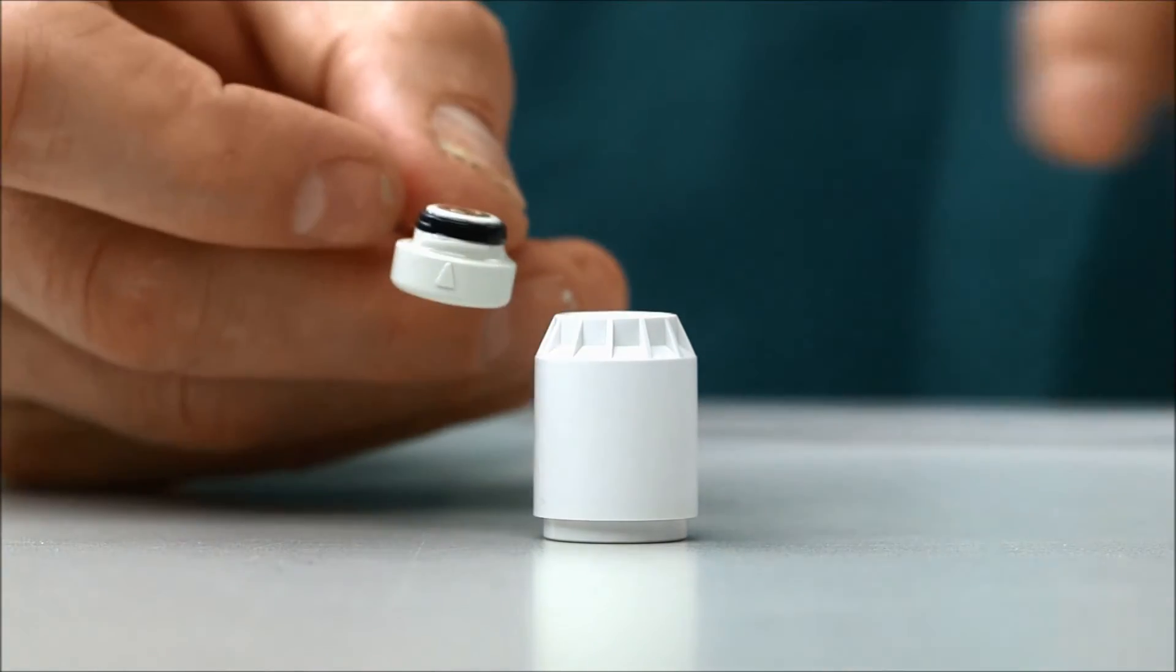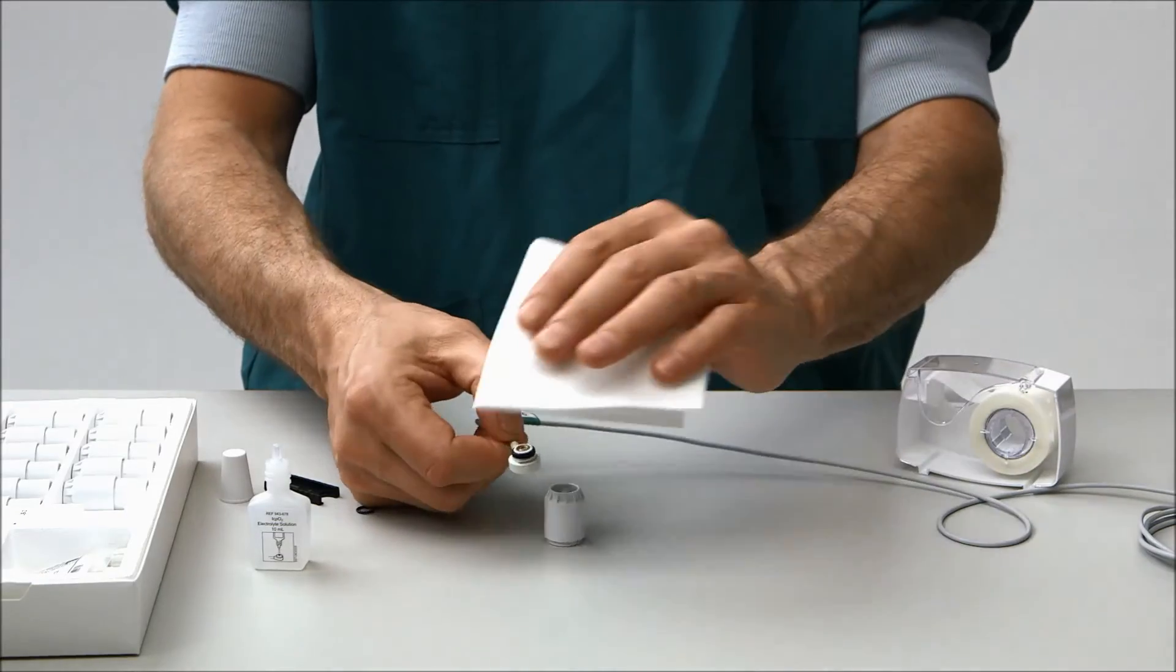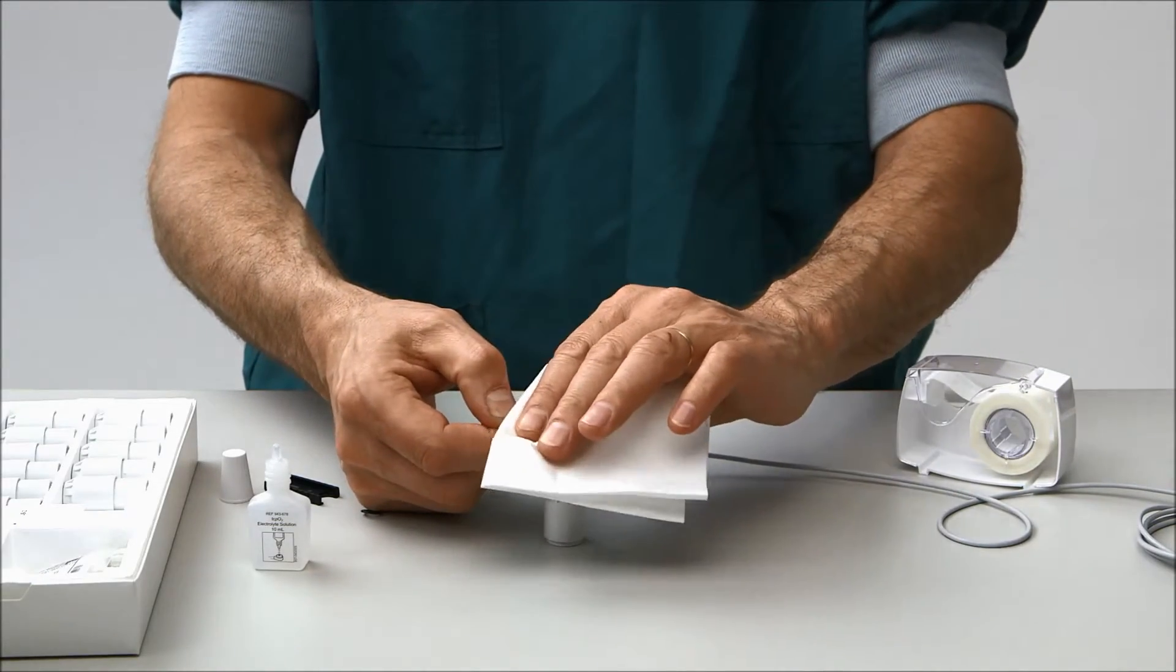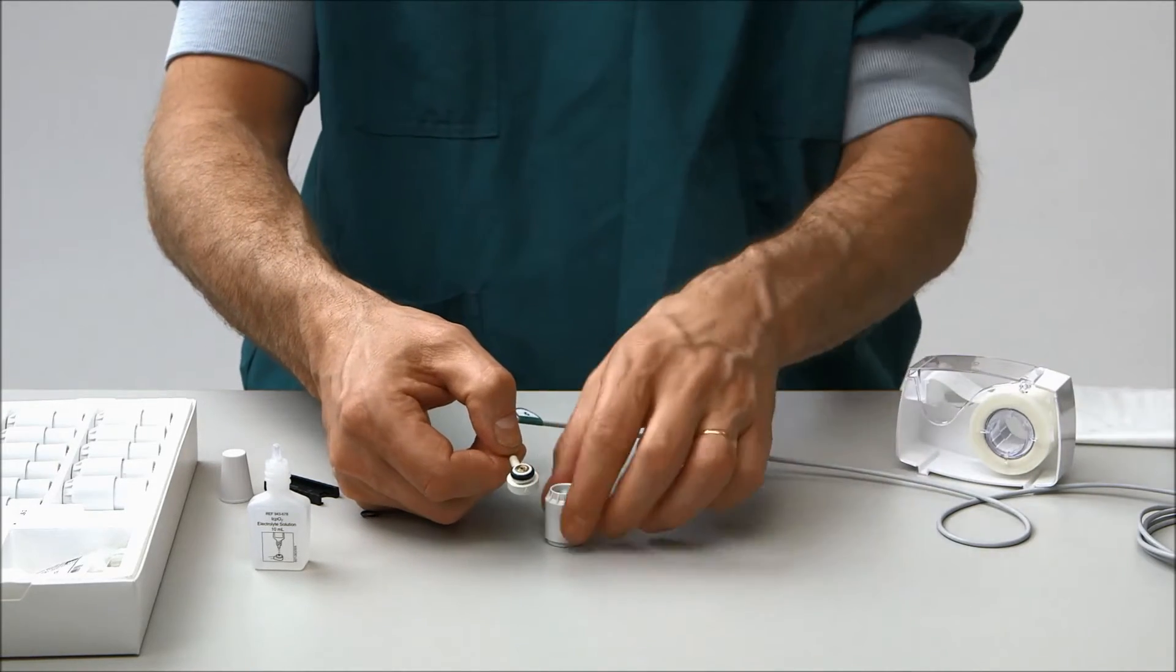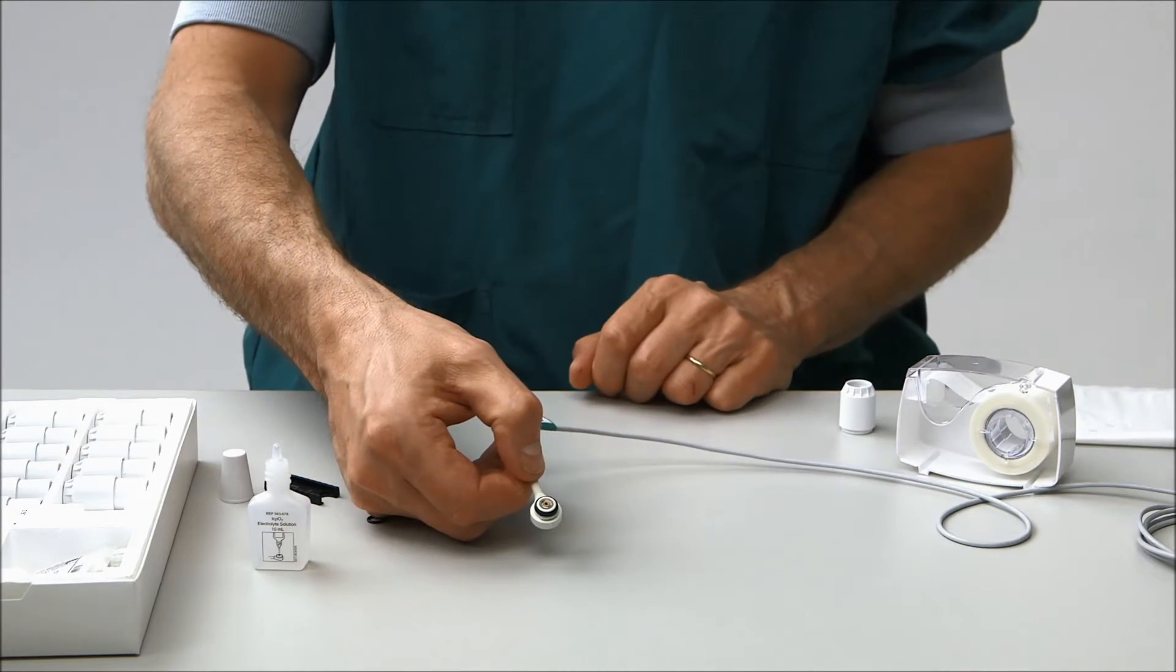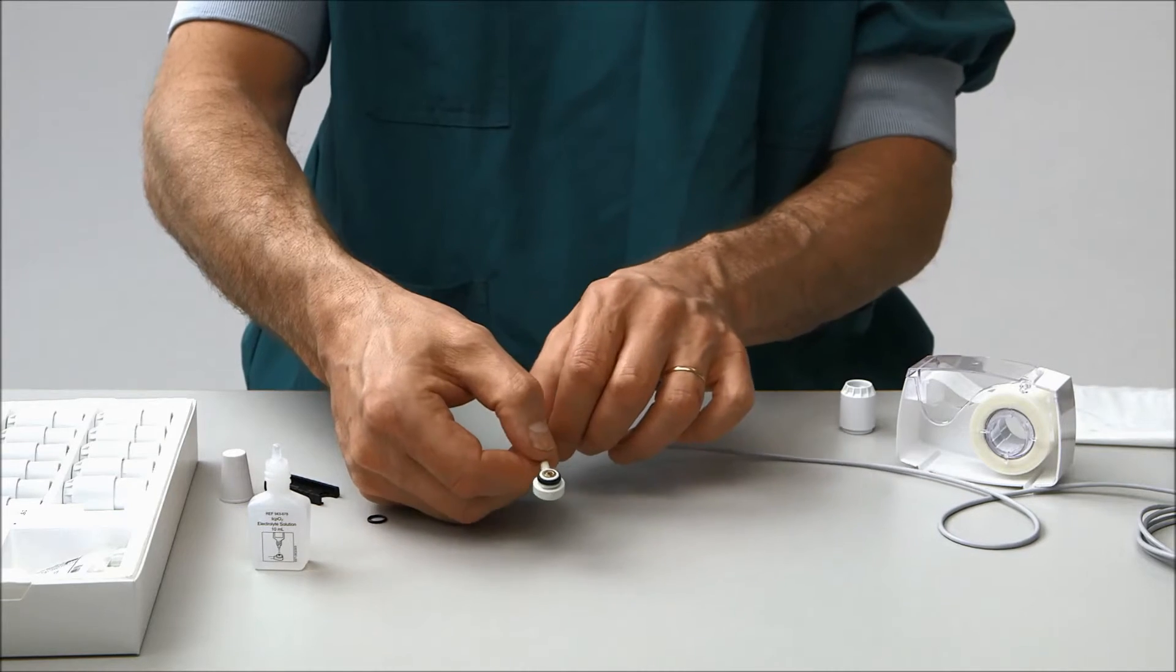Remove the electrode and wipe off any surplus electrolyte with a soft tissue. Inspect the electrode to make sure that there are no air bubbles. Place the electrode in the electrode holder.